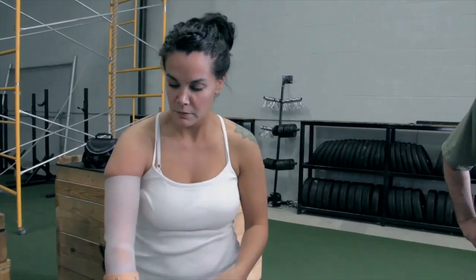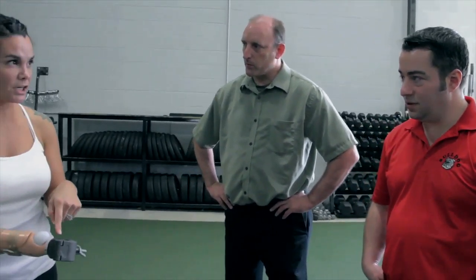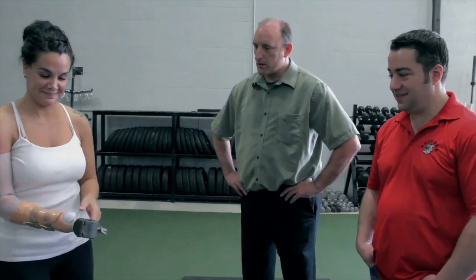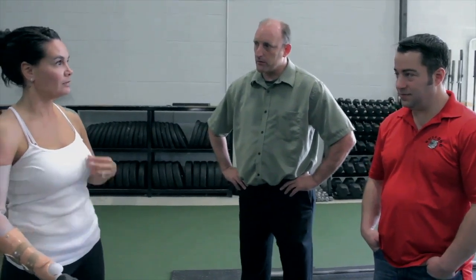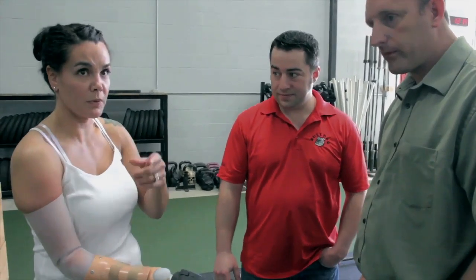What do you think, Bob? Can you tell the difference from your moving arm? I don't know yet — not until I start playing around with stuff.